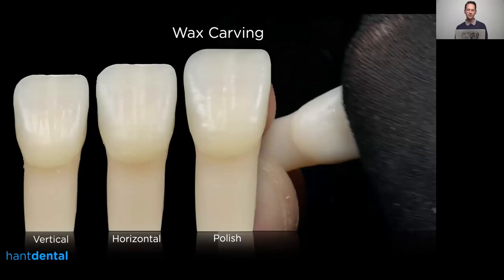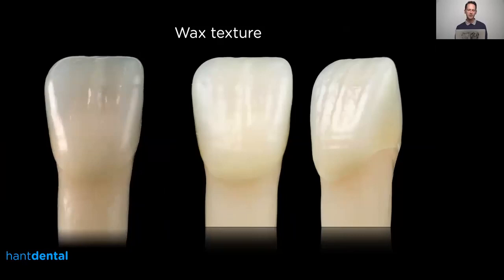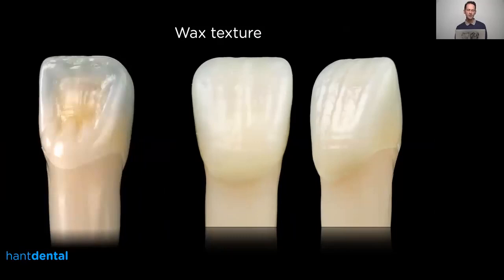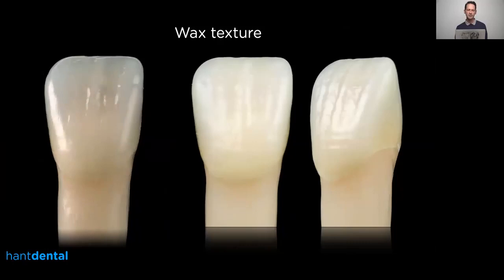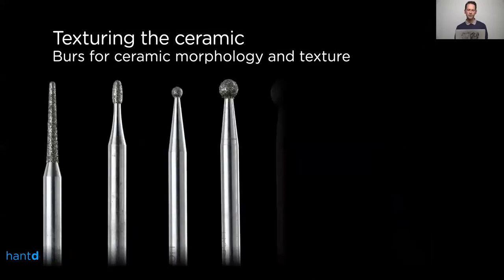I use the number 2 carving tool for creating the vertical texture and the number 3 for smoothing the vertical texture and creating the horizontal details. Here are the results — when you polish up the wax with a wet tissue paper or a nylon stocking you can nicely polish it up and create something that nicely imitates a ceramic texture. The shine quickly disappears when you touch the wax, but you can experiment with that, and it's a really good way to learn how to create a natural appearance and texture, because when you're polishing your ceramic restoration you basically do the same kind of polishing.